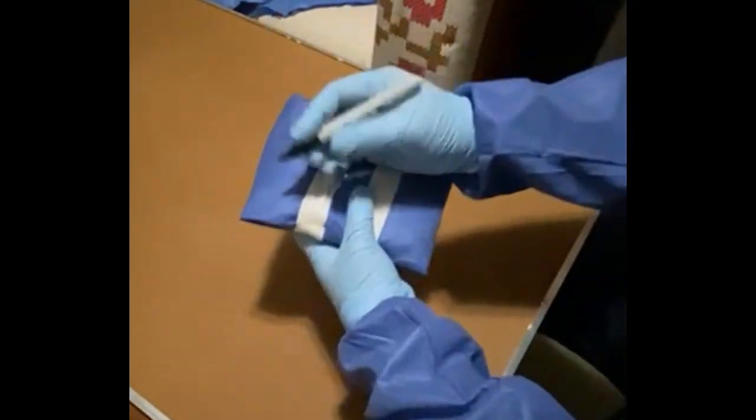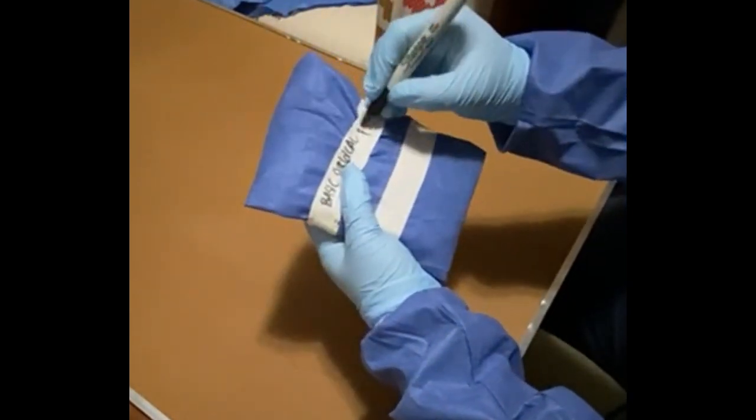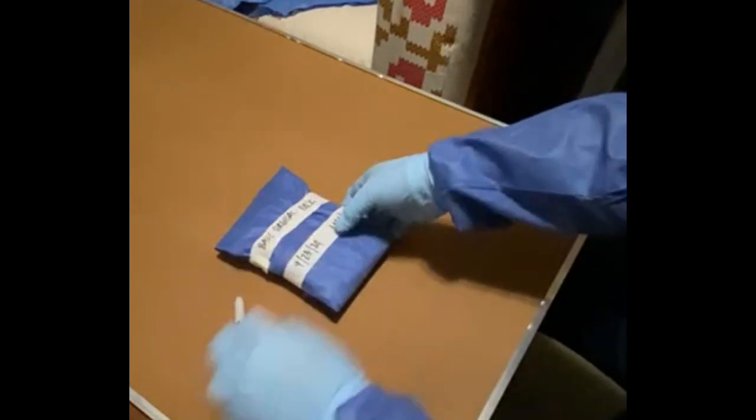Label the package with the contents, sterilization date, and other relevant information using a sterile marker. This helps with inventory control and ensures that the instruments are used within the recommended time frame.